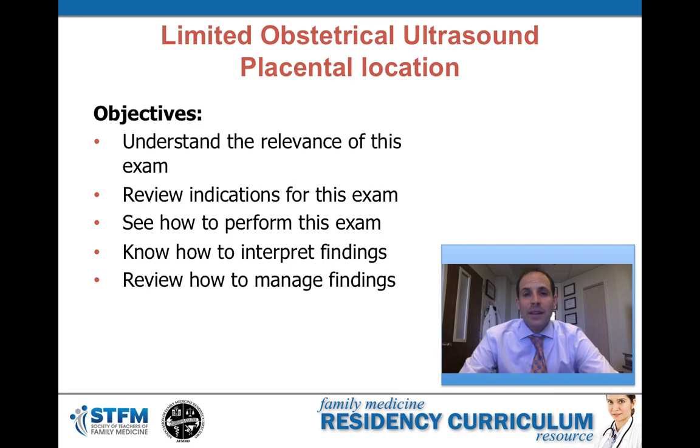As a disclaimer, there is a large amount of detail that can go into placental assessment, both with abdominal and vaginal probes. The scope of this module is to demonstrate how to perform a limited obstetrical ultrasound of the placenta in the midst of a point-of-care study, both for antenatal or intrapartum use.